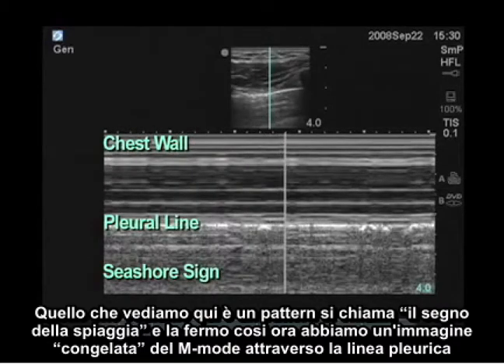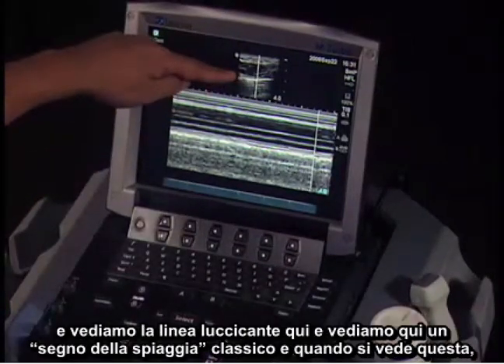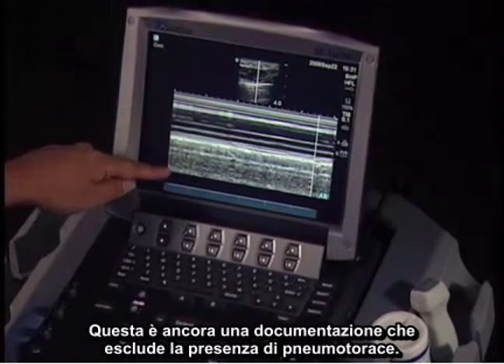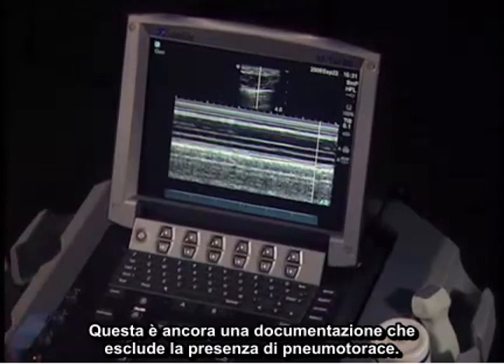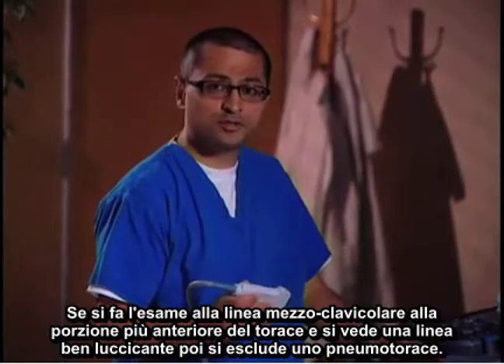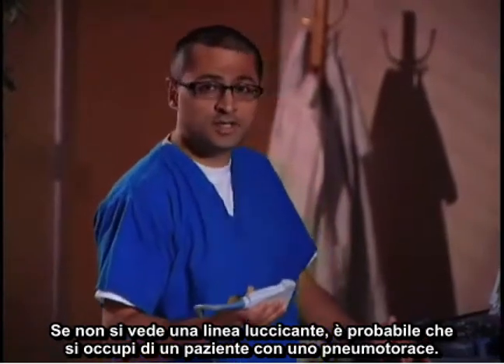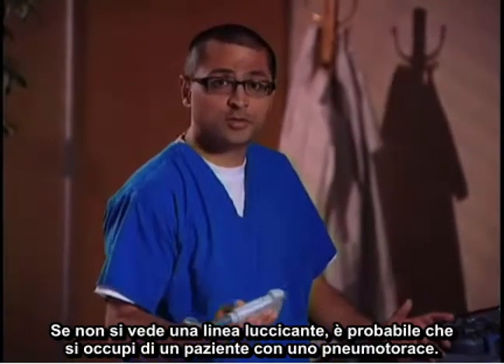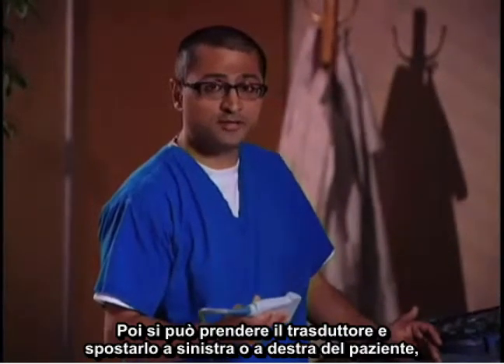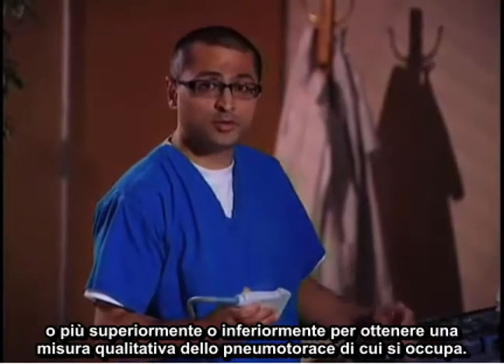What we see now is a pattern called the seashore sign. I'm going to freeze this — we now have a frozen M-Mode image through the pleural line showing the shimmering line and the classic seashore sign. When you see this, it is still documentation of exclusion of a pneumothorax. If you do your exam in the mid-clavicular line at the most anterior portion of the chest and see a good shimmering line, you've ruled out a pneumothorax. If you don't see any shimmering line, you're most likely dealing with a pneumothorax, and you can move the transducer left, right, superior, or inferior to get a qualitative size of the pneumothorax.